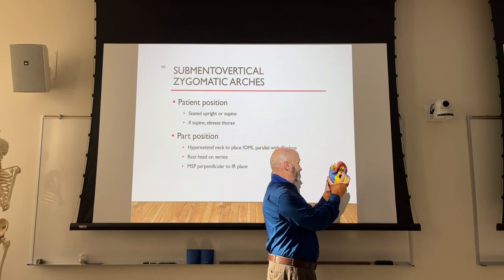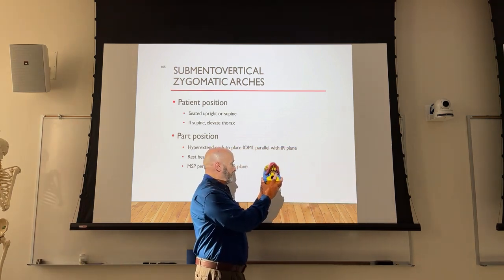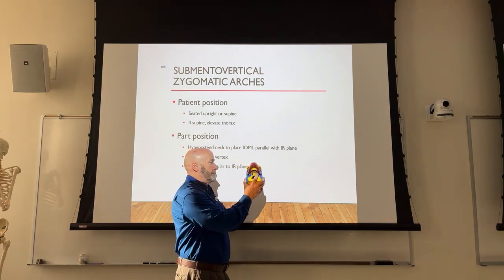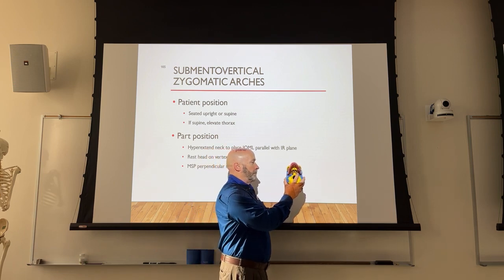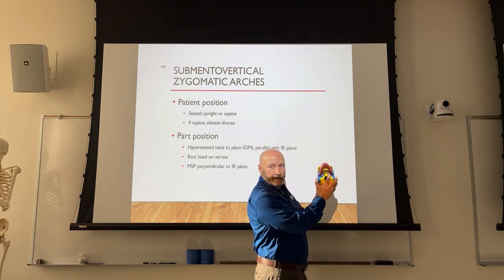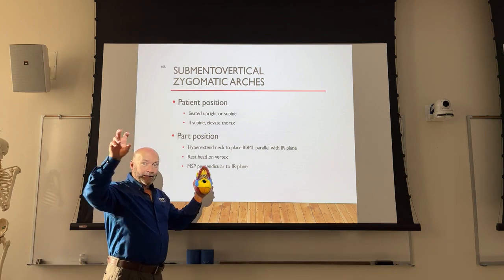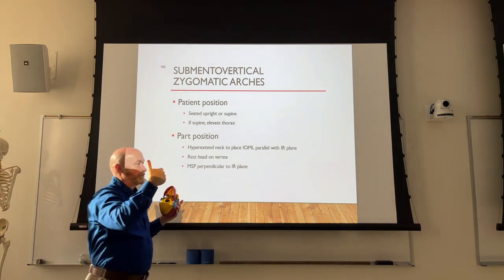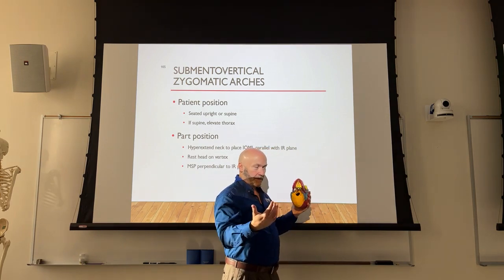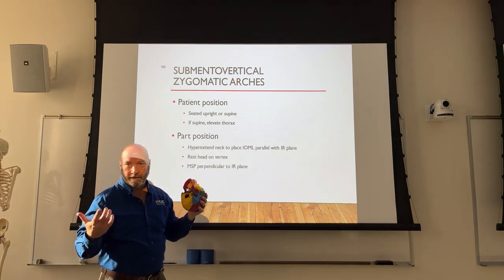look what's happening. All the way over here, it projects out so far. I probably tilted inadvertently, so let's try it again. I'm not even going to look at the screen this time. Tell me when you can see it, if you can see it. Okay, all right. So you see what's happening here is that because of the divergence of the central ray, so to speak, with the great divergence of the central ray, you'll project the zygomatic arches away from the top of the head.